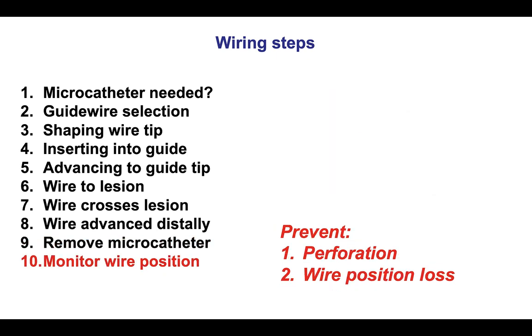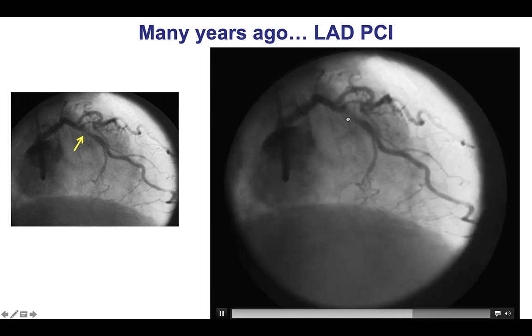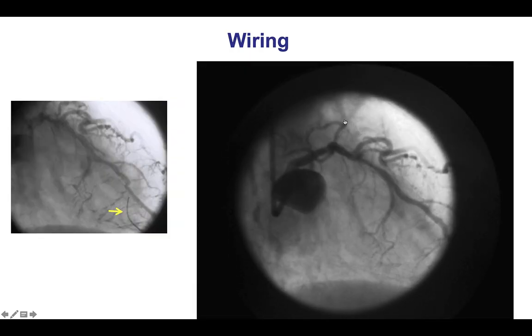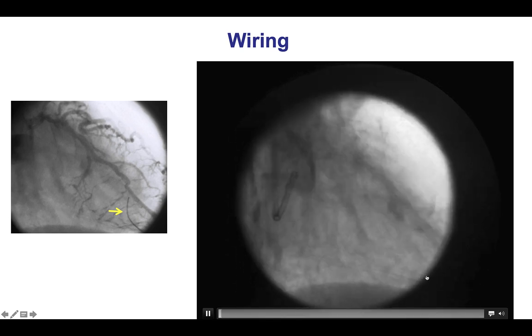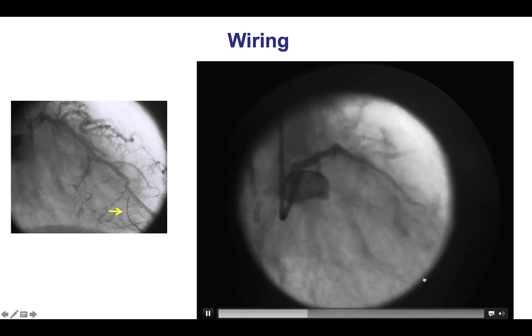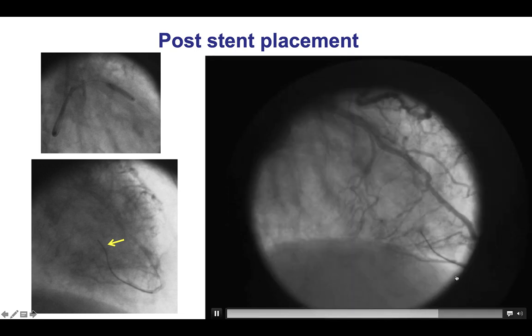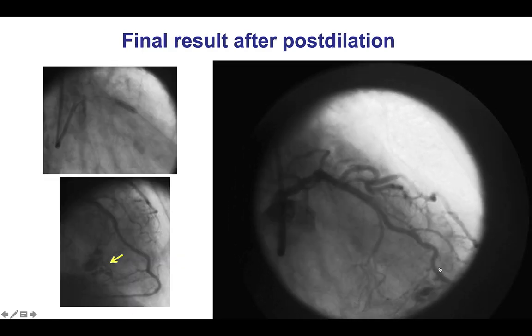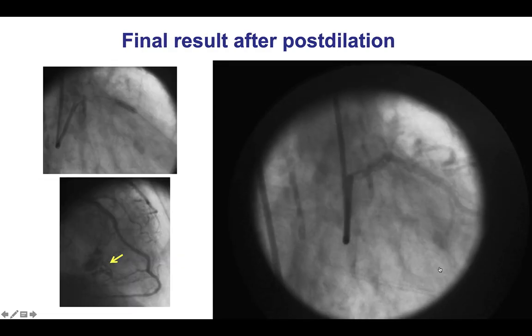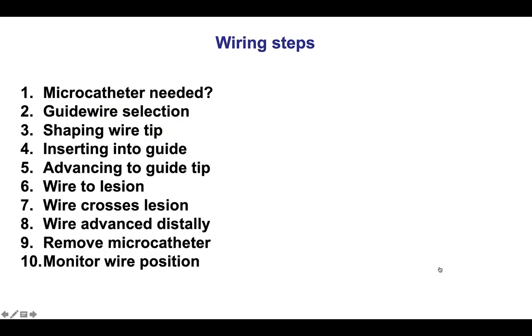The final step of wiring is to keep an eye on the distal wire position. If it goes too far it causes a perforation; if it comes back, the position can be lost. In one example, a mid-LAD lesion was successfully crossed but the wire was a little too far down. Part of the challenge is that when coning is done to minimize radiation doses, we may not get a good view of the distal guide wire position. A stent was placed with a nice result, but the wire still seemed a little too far — and then after the stent was post-dilated, there was a distal wire perforation. The wire should not go too far and we should always watch the wire tip.